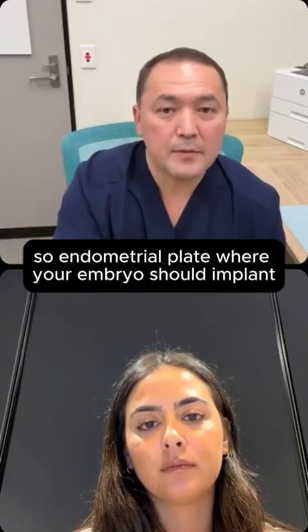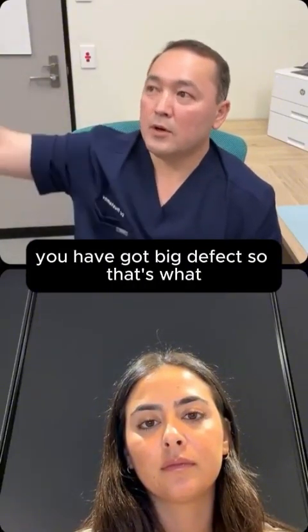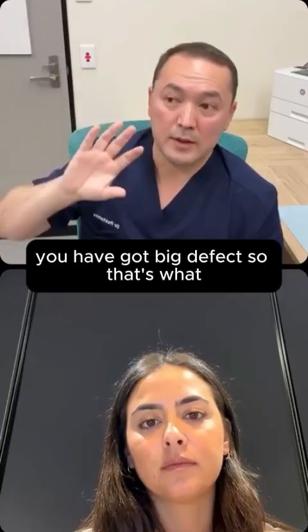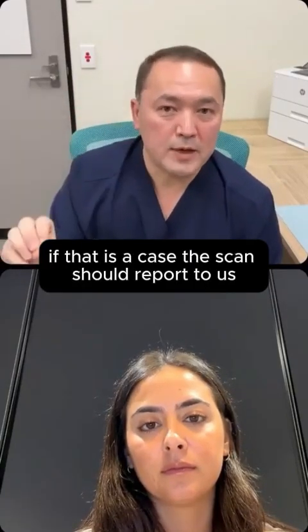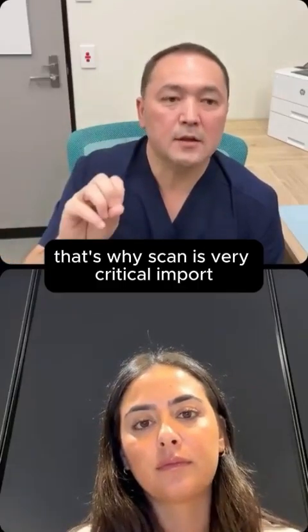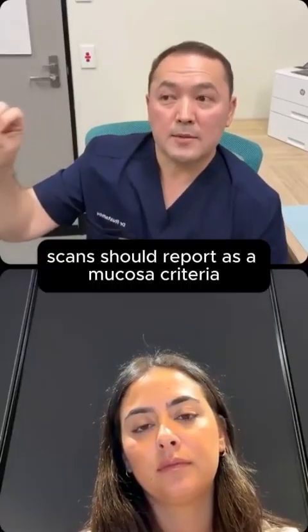So the endometrial plate is where your embryo should implant. Just imagine the embryo is trying to implant and you have got a big defect. If that is the case, the scan should report it to us. That's why the scan is a very critically important tool in IVF. The scan should report it as per MUSE criteria.